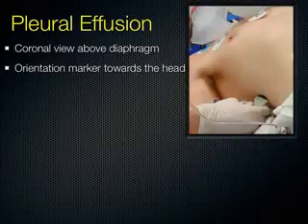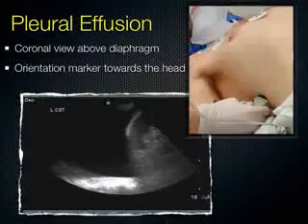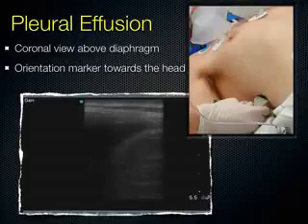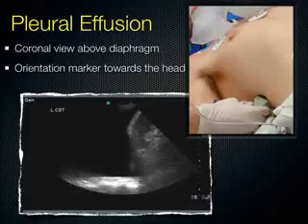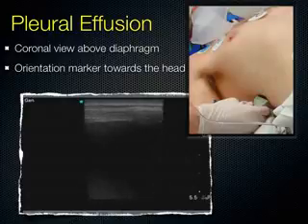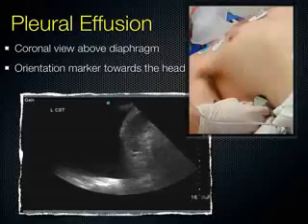So you can imagine, with the dot towards the patient's head, you have liver, diaphragm, pretty clear, and right above that, if you see blackness, what is black? What turns out black in ultrasound? Fluid. Right. What does air look like in ultrasound? Air doesn't look white. Air, you can't see air. Air just scatters the picture, right? Air doesn't conduct ultrasound well. So basically, if you have air, I'll show you what happens when you have air in just a moment, you get a different kind of picture.